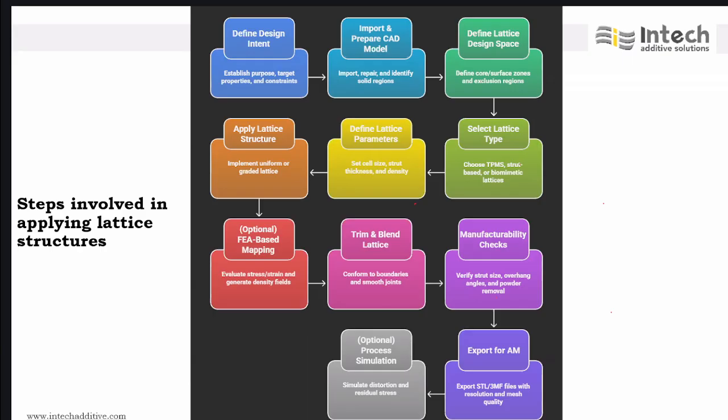Same unit cell, same unit cell size across the part. If it is going to be graded, you keep varying it hierarchically across the part.